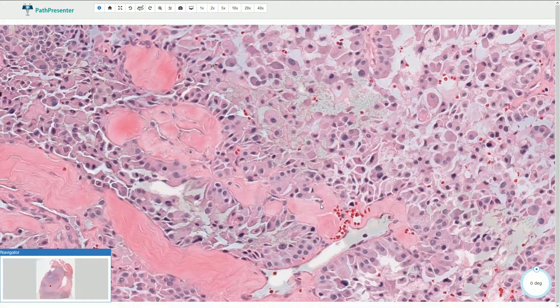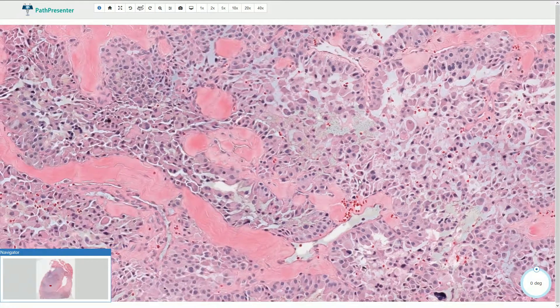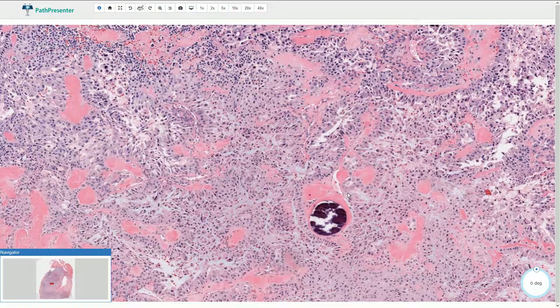Because the cells produce calcitonin, they would be positive for calcitonin on immunohistochemistry. They are also neuroendocrine cells, so they would be positive for neuroendocrine markers like chromogranin and synaptophysin.